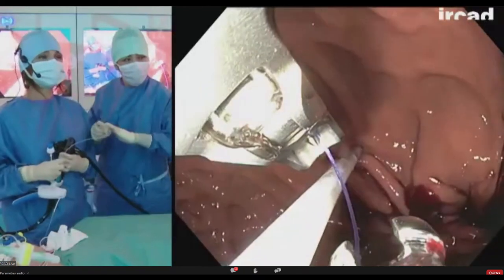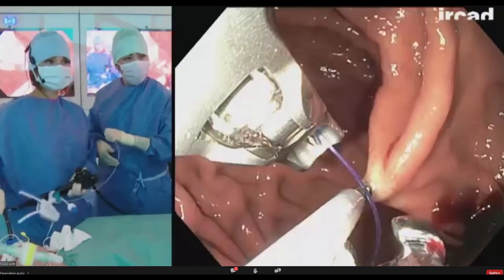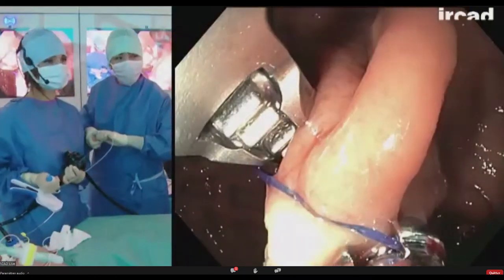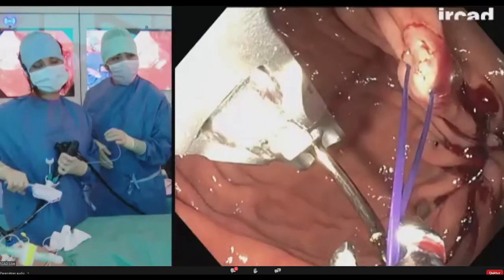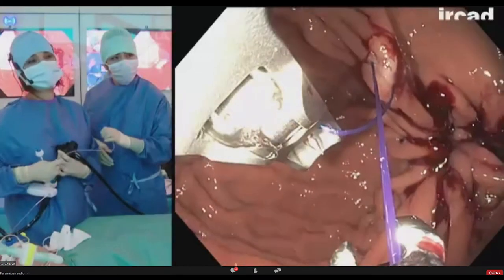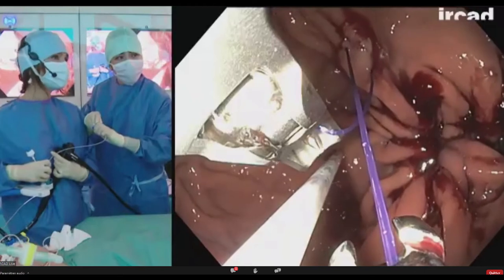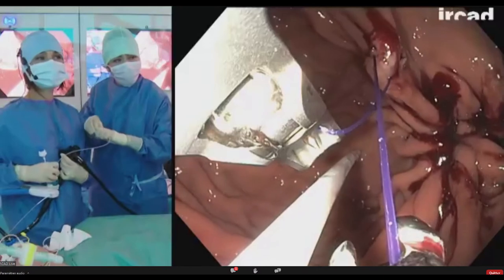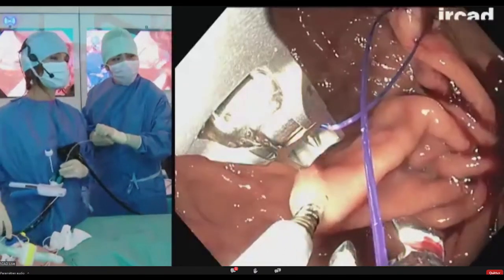Okay, go ahead. I think that the learning curve really depends on your endoscopic skills. This is not a procedure for somebody who has never done endoscopy before. I think it's very easy to learn for surgeons that are endoscopists, because the most complex thing is to understand the anatomy. The device can be learned. The use of the device is not a big deal. We do things in surgery that are much more complex. And the technicality of the device can be learned in the lab very well.